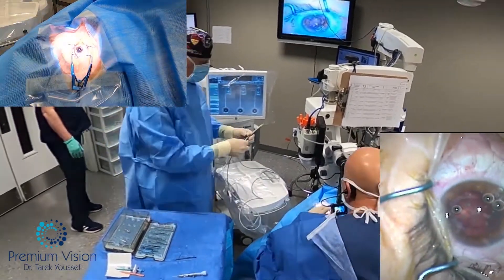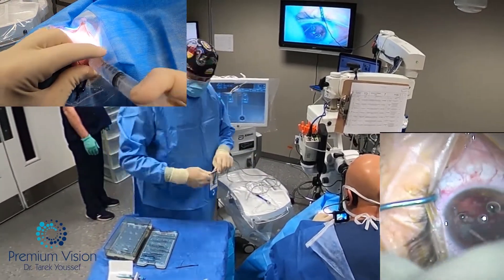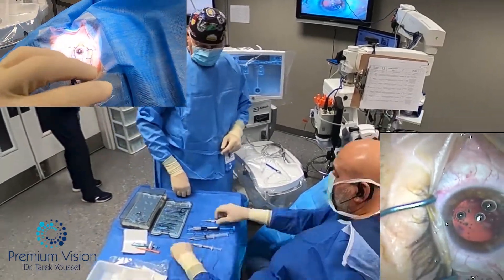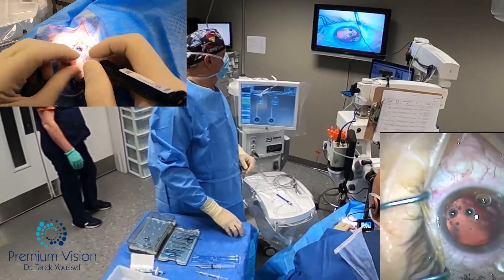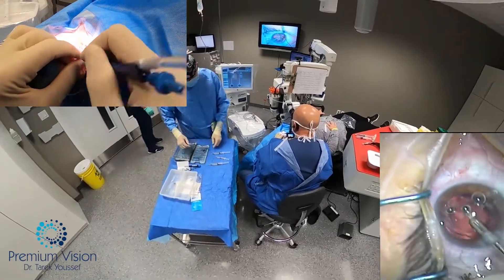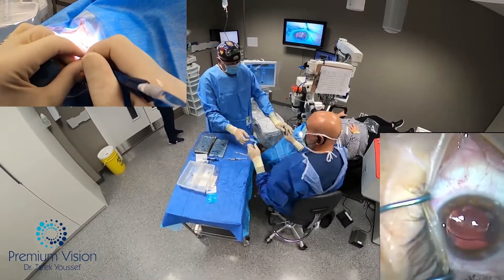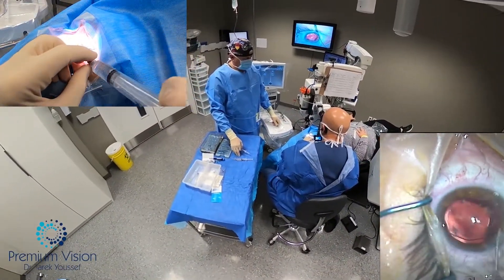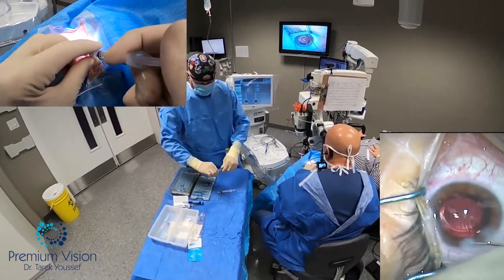The nucleus is removed and then the J-Canula cortical cleanup. You notice the air bubbles in the chamber are not moving because of the J-Canula — there's no turbulence against the cornea, to keep it safe. I've inflated the bag with Healon and implanted the lens, which is the Eyhance DIB00 lens from Johnson & Johnson. Inflated the chamber with BSS, hydrating the wound with Moxifloxacin.